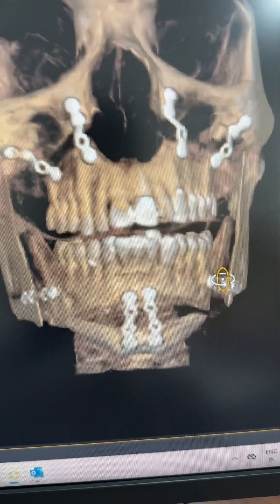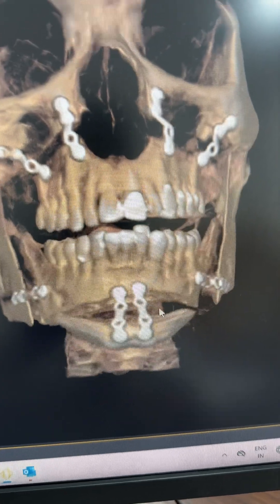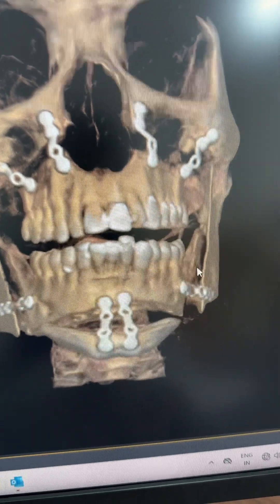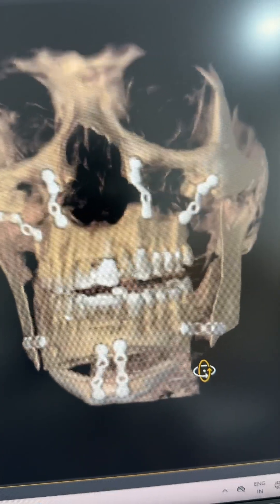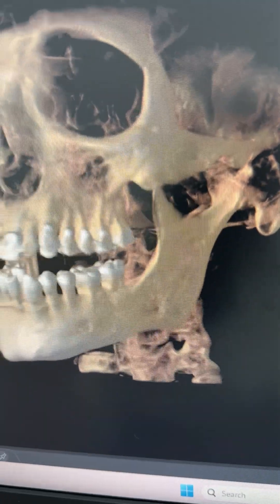You can see here we've left more gap in between this segment and less gap here, and all of this is done to increase the projection of the patient's left side face, because you can see the left side of the mandible.